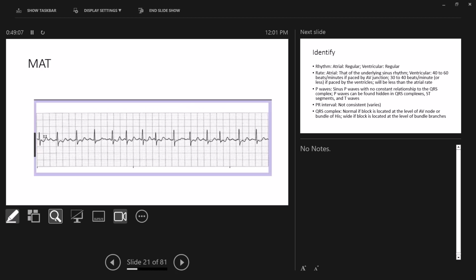Yes. Why does it kind of seem like on the left side of the strip there's a T wave and then possibly another P wave? I guess that could just be the negative deflection when the QRS begins, but it almost looks like another P wave. It just looks like there's a lot in between the complexes, where I thought with MAT there was still one P wave and one T wave for each complex, even though they were irregular with different morphologies.